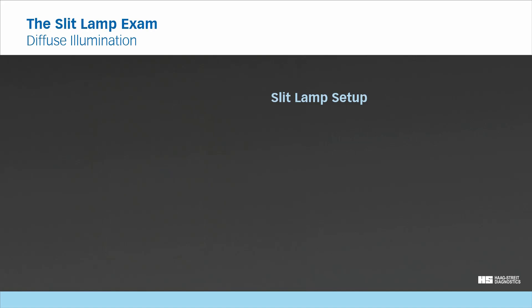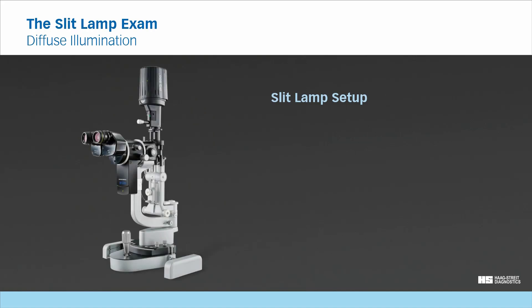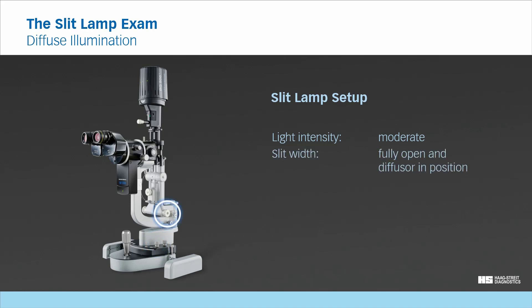Slit lamp setup. To set up the slit lamp, choose a moderate light intensity. Bring the diffuser in position and open the slit completely. Alternatively, you can switch on a dedicated background illumination. Select an illumination angle of around 30 degrees to ensure even illumination. A magnification of 6 times or 10 times is recommended.